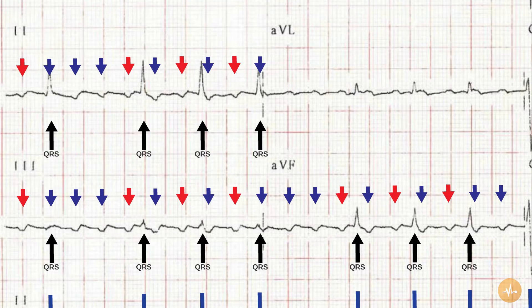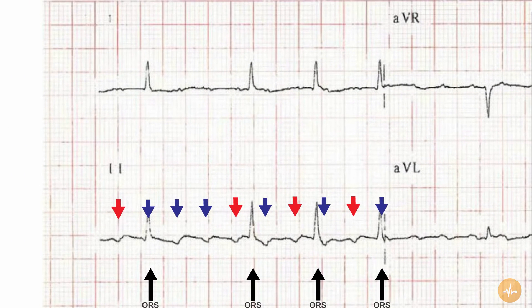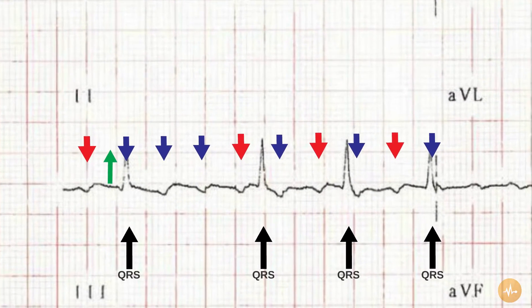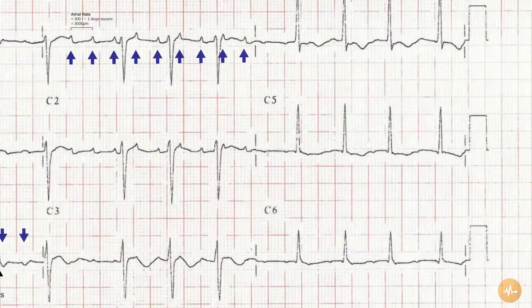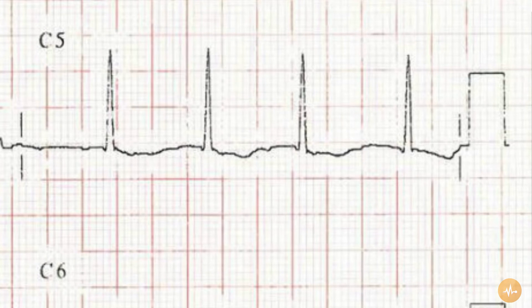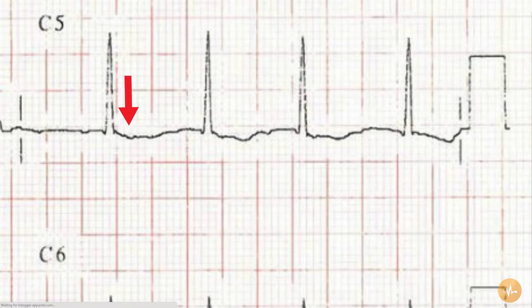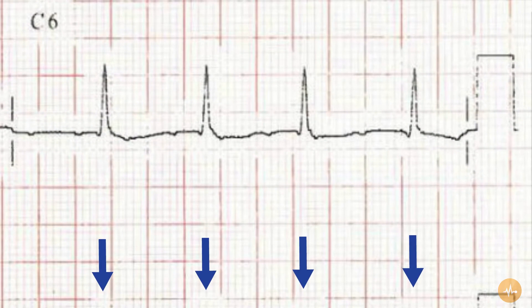The axis is normal with an upwards complex in lead 1 and 2. The QRS duration is normal at less than 3 small squares. There is sagging of the ST segment in leads V5 and V6.